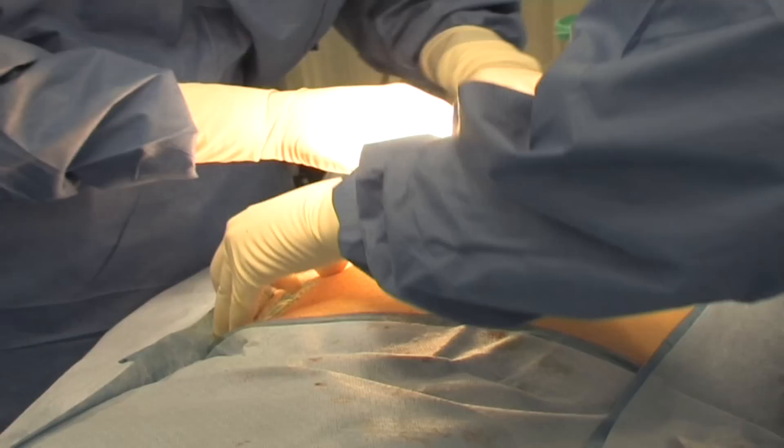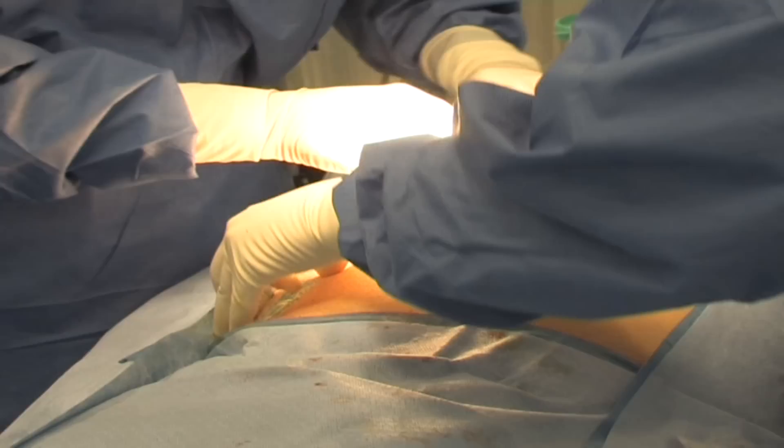Opening the specimen at the end of the operation reveals thickened bile and numerous gallstones.